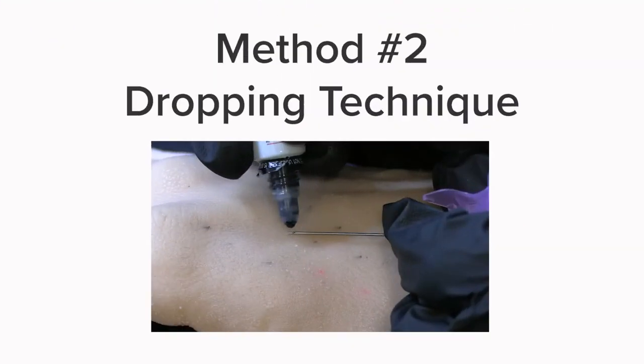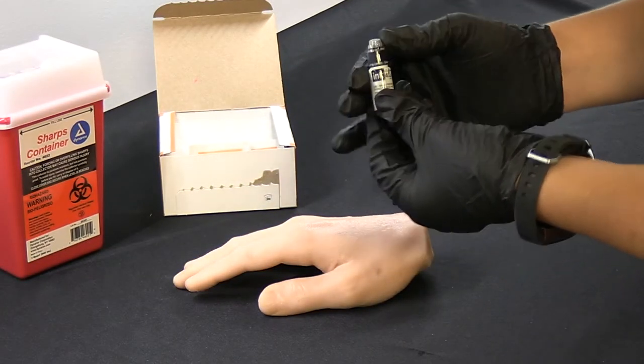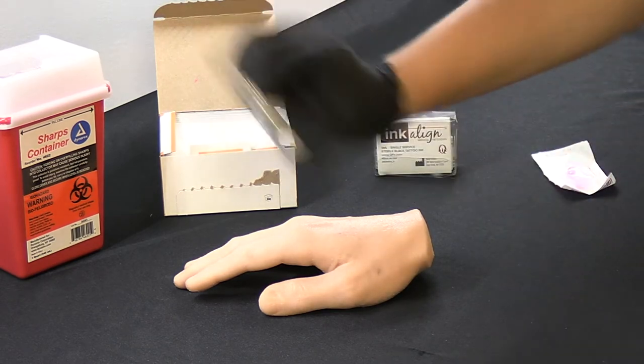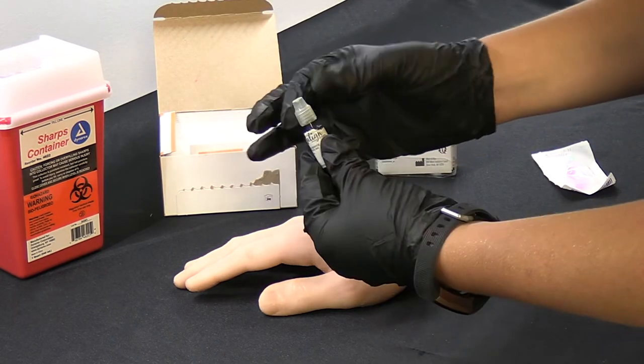The second method is the dropping technique, which can be used with a dropper bottle or the single-use applicator. Verify that the Ink Align packaging is sealed and unopened. Remove the heat seal and shake well, then twist off the cap.